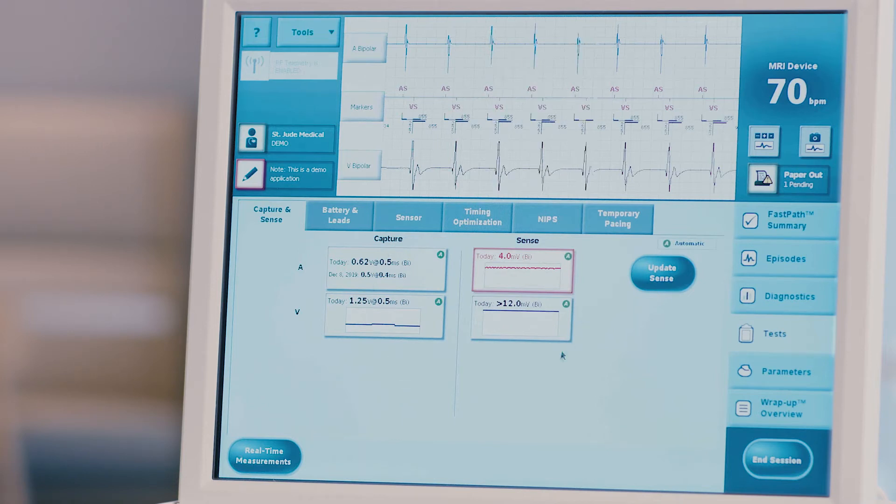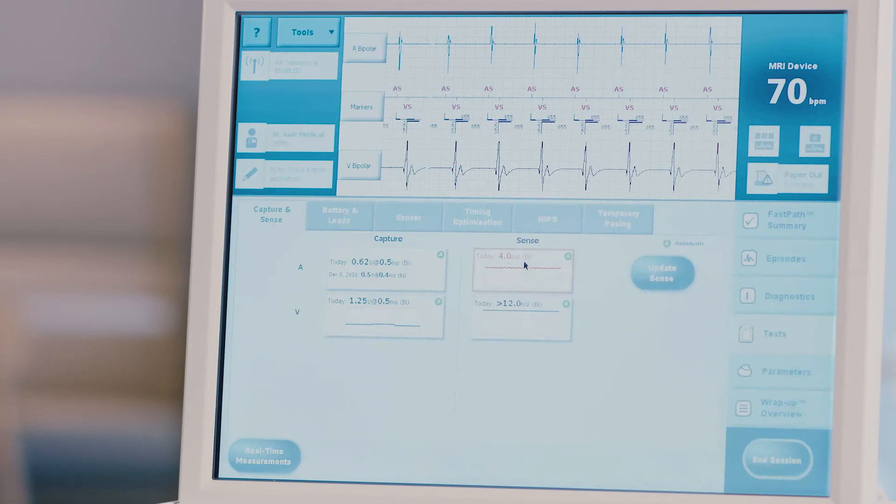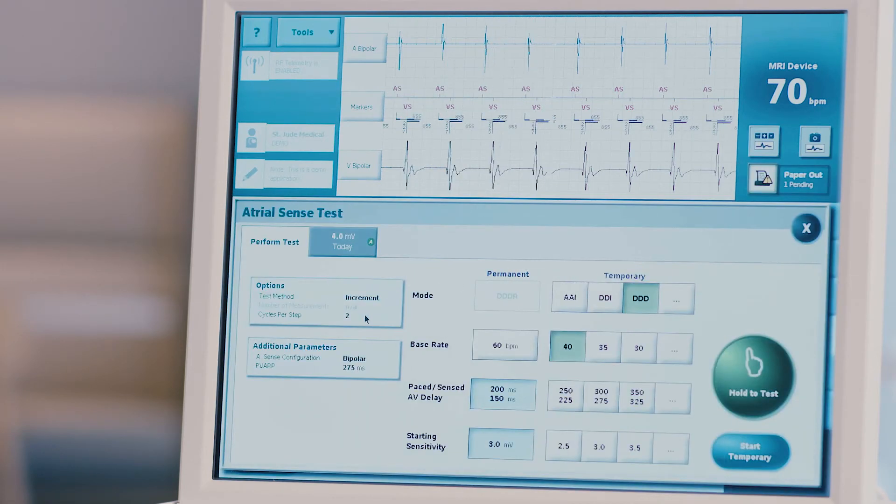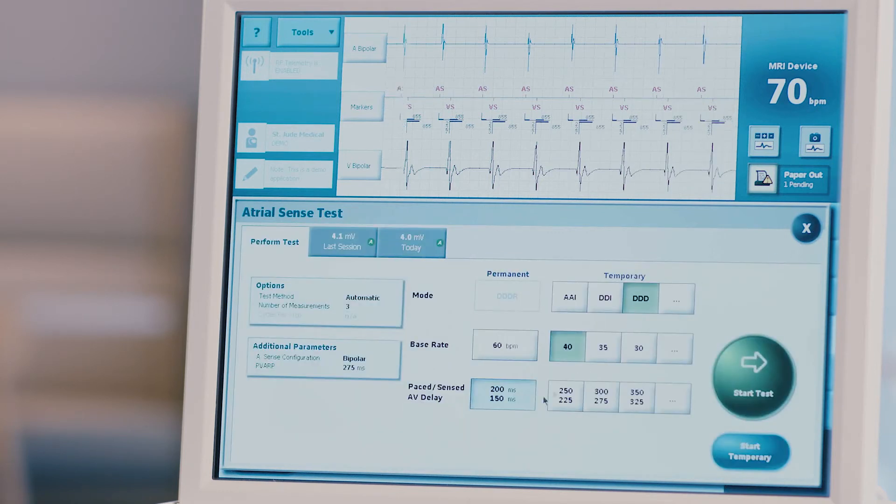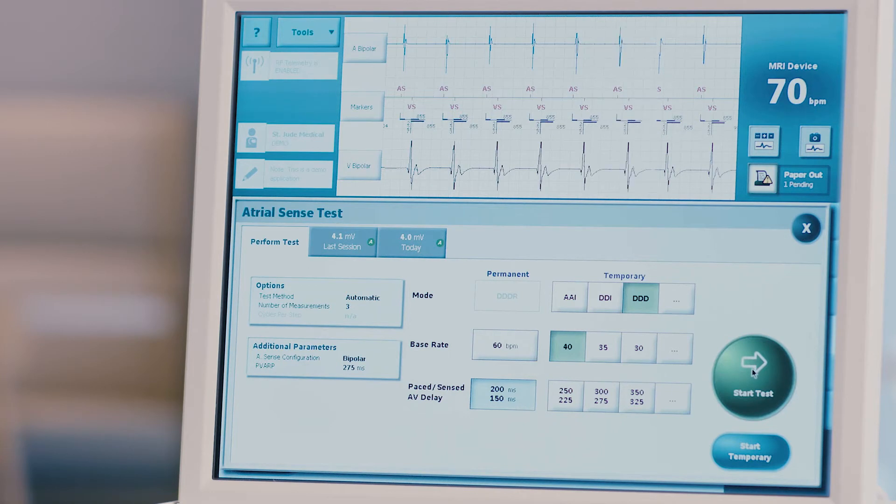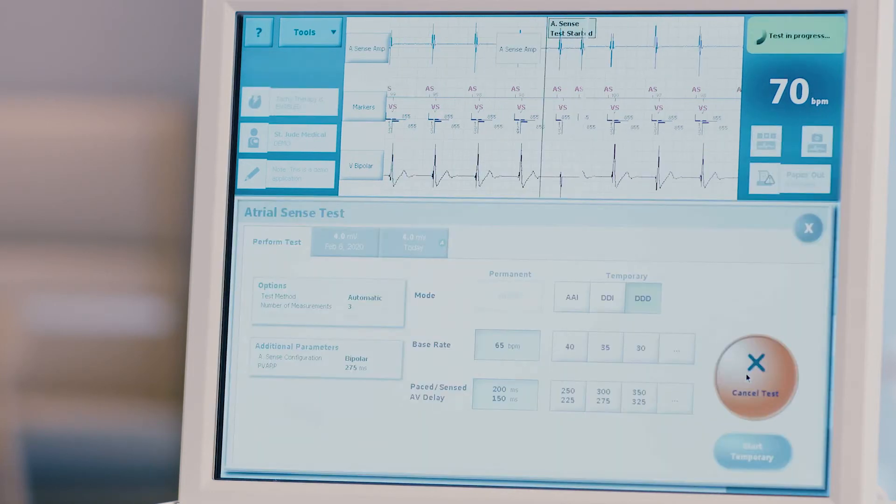Complete any necessary tests that have not been automatically performed. Press any box that is noted not performed to open the manual testing screen. Make the appropriate settings adjustments per the recommendation of the healthcare provider or certified Abbott employee. Press the start test button or hold the button as directed for manual threshold testing.